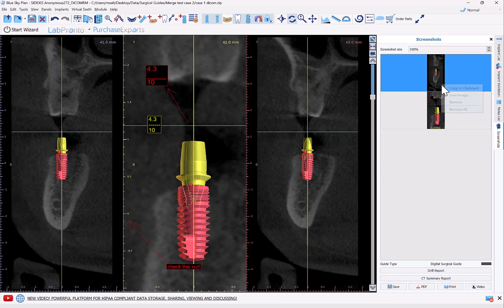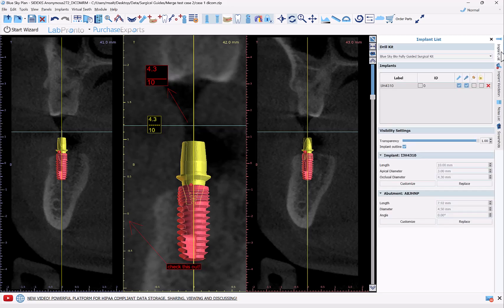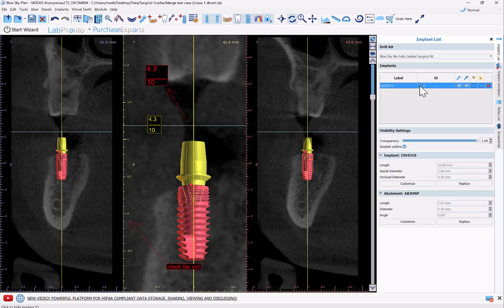If you go back to the screenshot functionality and take a screenshot now, it's added to the basket with the annotations and notes included. You can see the screenshot with the notes, and the implant ID number is added as well. In the implant list you can see the ID, which you can change to whatever value you like.